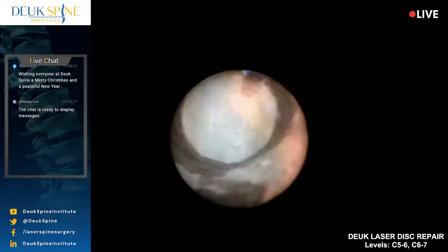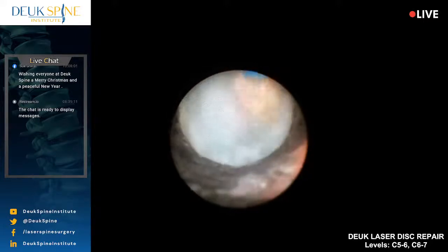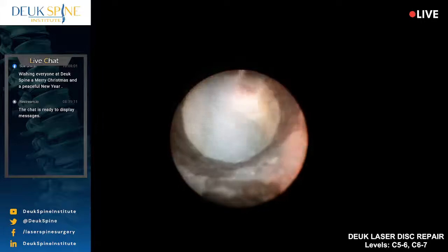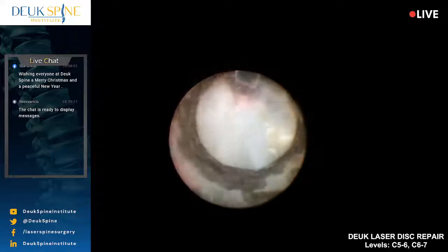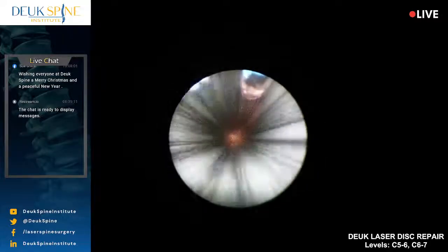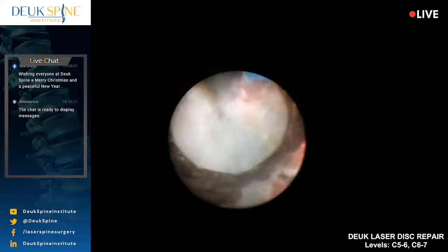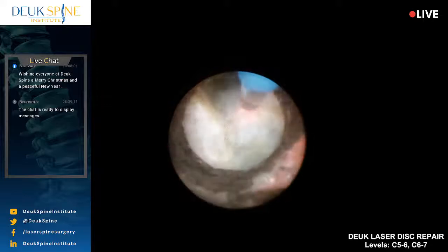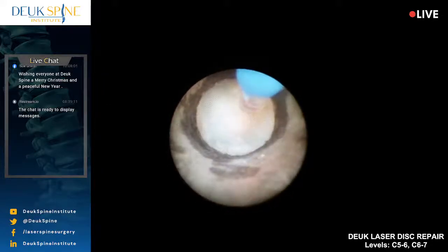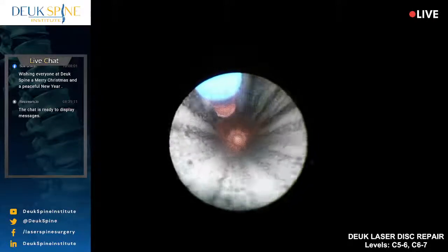All right, so more scar tissue right here from the tear. At some point, we're going to get to, this is all calcium right there. Calcium, the gold color, is calcification. That's your osteophytes, little baby osteophytes, all growing up. It's like a nursery, pathological tissue is like a nursery for osteophytes. We call it dystrophic calcification. Look it up in pathology books, you'll learn about it. Dystrophic calcification is when you get calcium deposits in abnormal tissue, and this is clearly abnormal tissue.